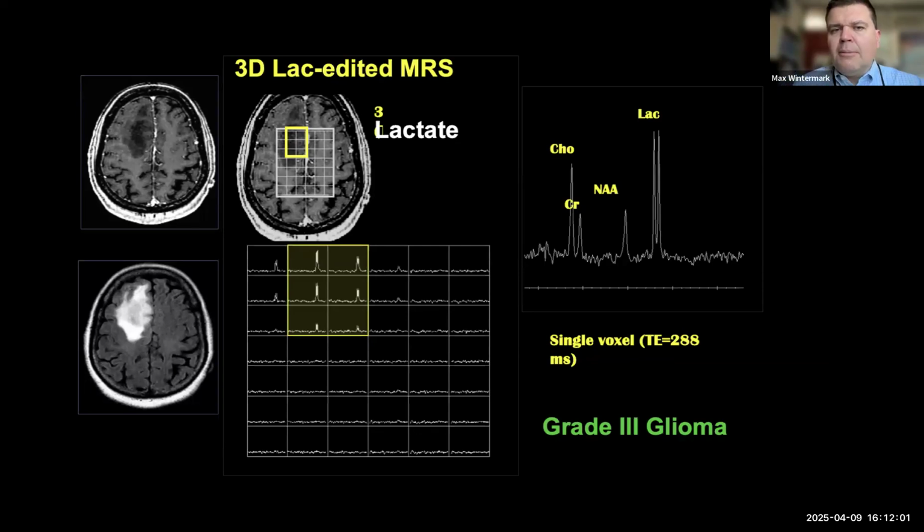That's why having perfusion imaging and spectroscopy and seeing a convergence of the results helps you. But there is no one perfect technique with 100% sensitivity and specificity, in part because they're influenced by various conditions, not just brain tumors.